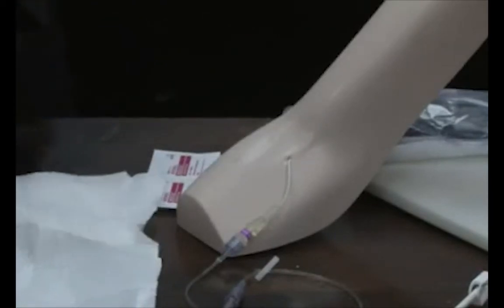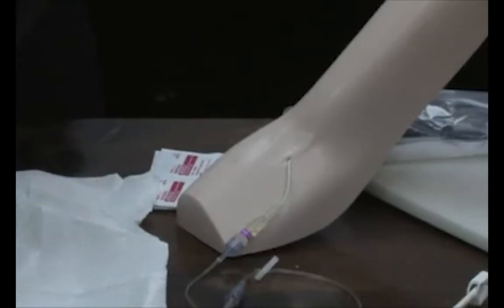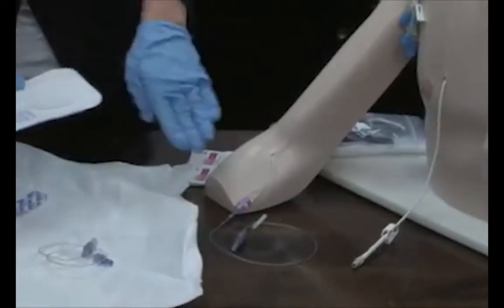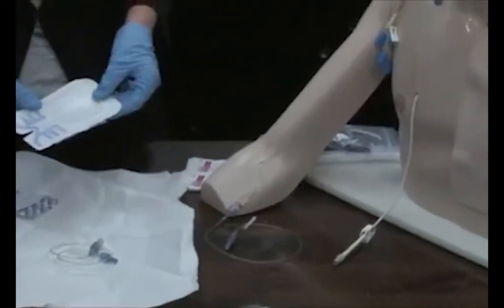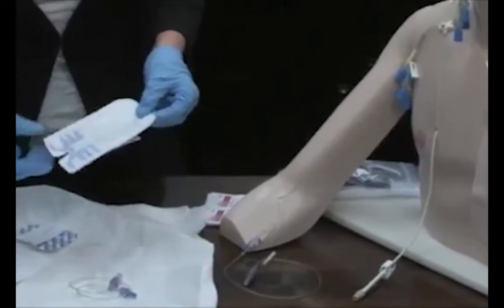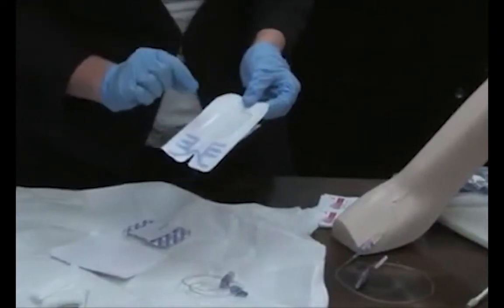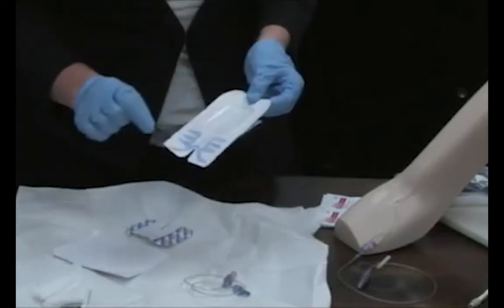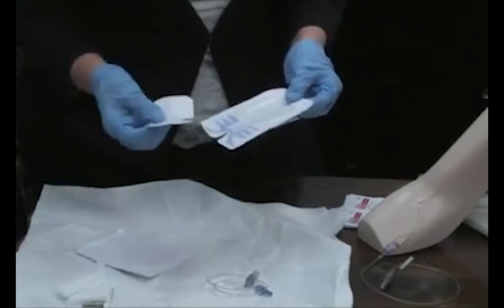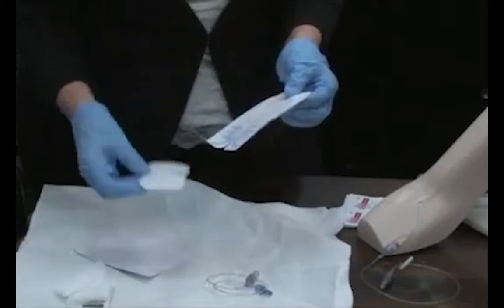So our site has been cleaned. And I'm going to show you how to use the Sorbaview on the chest here, since I don't have the extension to the arm on this little guy for the PICC line, but the process is the same. The good thing about the Sorbaview dressing is you do not need any other securement device. It is a dressing change and a securement device all in one. I've seen a lot of people in skills place this piece on first and then complain about how hard it is to get off. This piece goes on last.